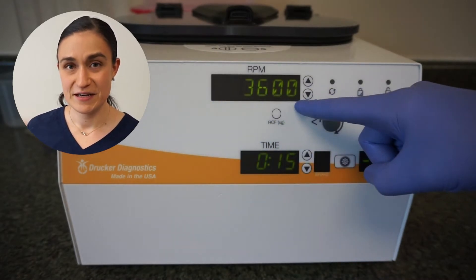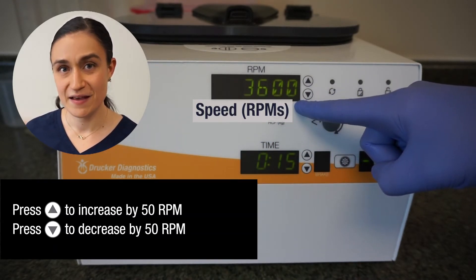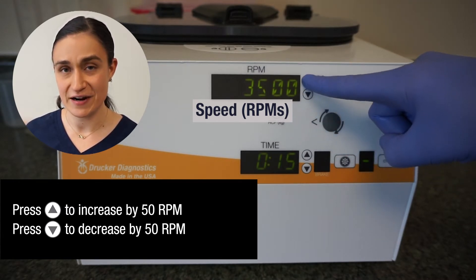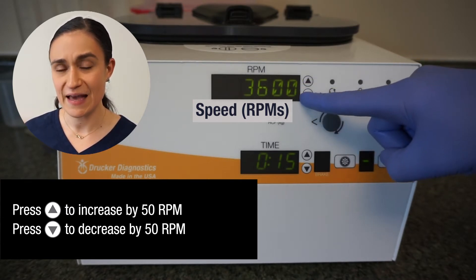The RPM screen displays my currently selected speed in RPMs. I can adjust this using the up and down arrows to the right of the RPM screen. A single press up increases by 50 RPM, and a press down decreases by 50.